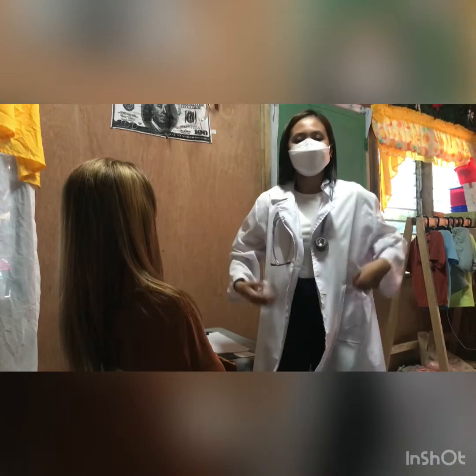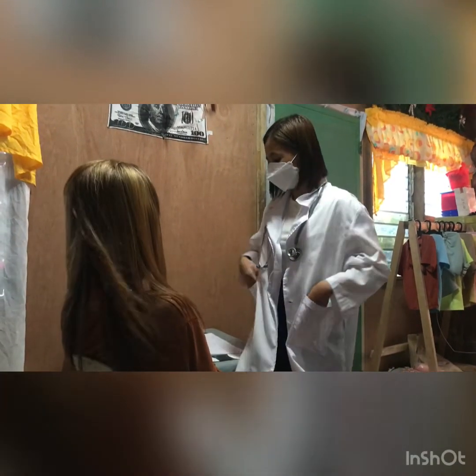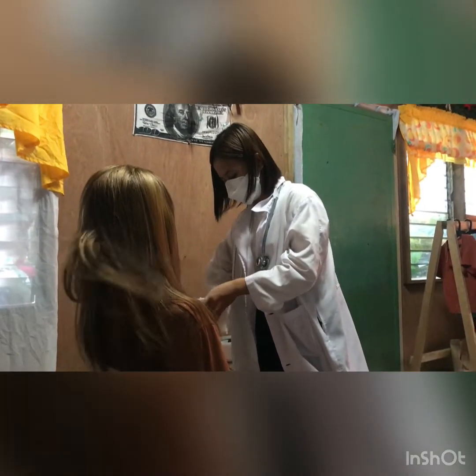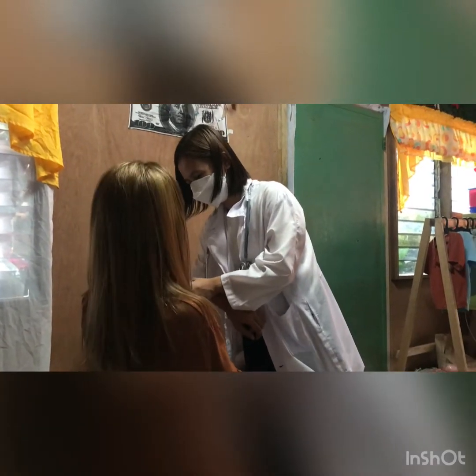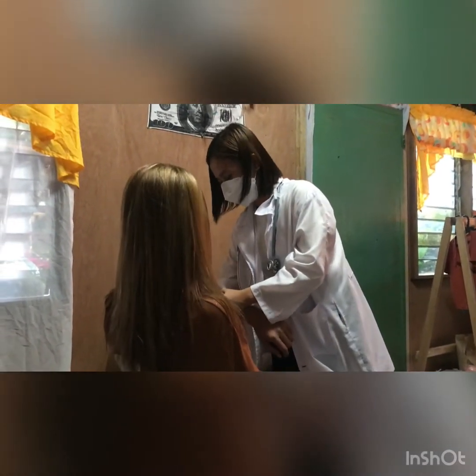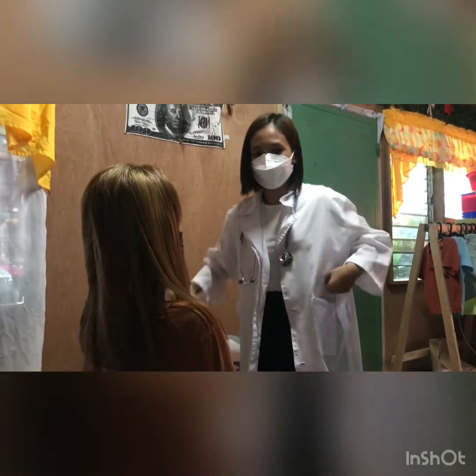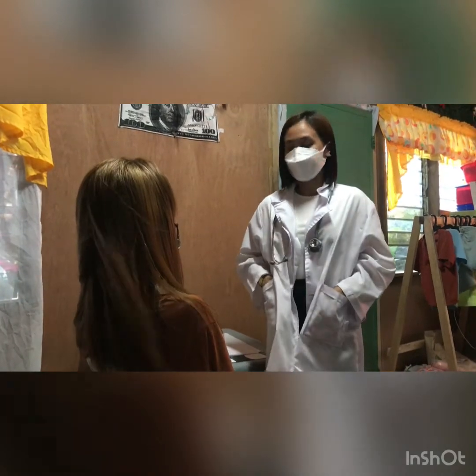Then, if the axilla is moist, dry it with the patient's towel using a patting motion. And after that, with a cotton ball, wipe the thermometer. And after that, remove the thermometer from the container.